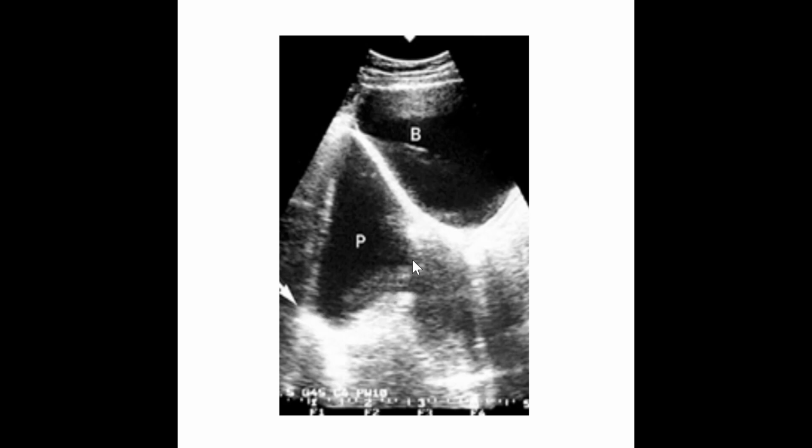This is very common to see in regards to the bladder. Again, we've got a lot of bowel gas in this area, which helps to create that multipath artifact. As is the case with most of our positional artifacts, just changing your angle of insonation is going to help a lot with the multipath artifact.